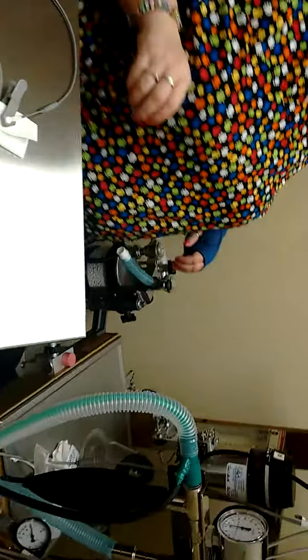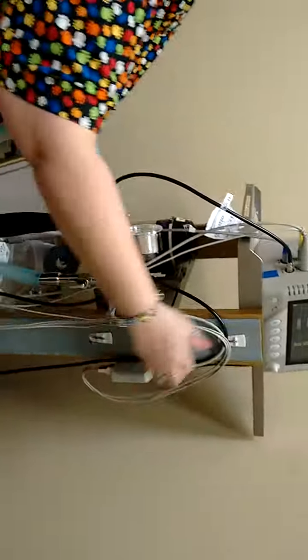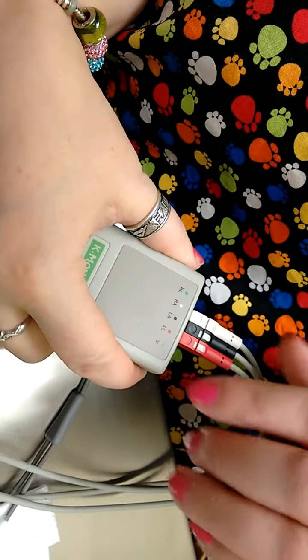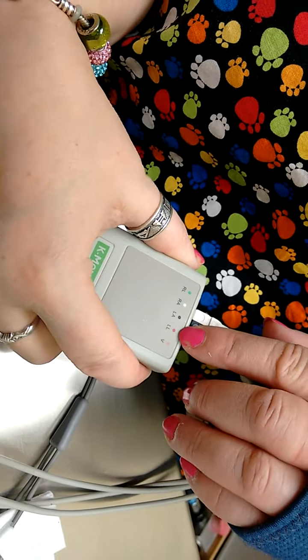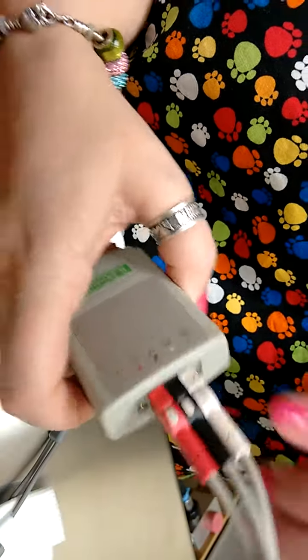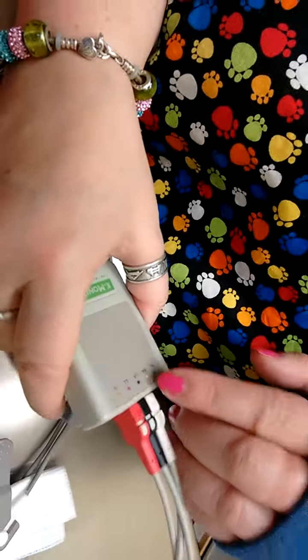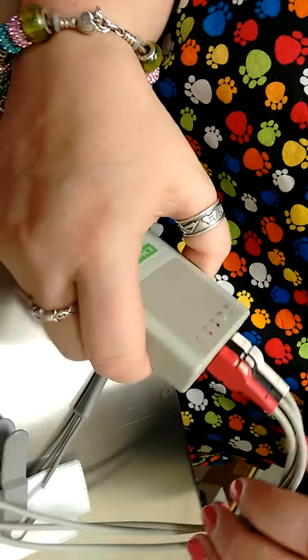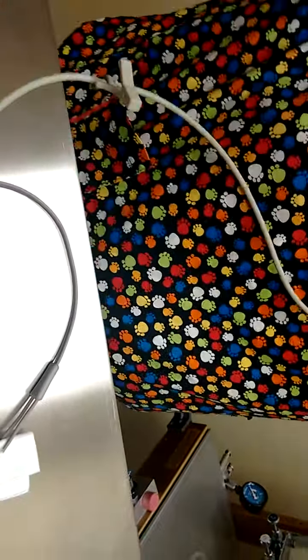What about the ECG? The ECG is labeled. It will say right arm, right leg, left arm, left leg. You could essentially have more. We only have right and left front and left hind, and it's enough. Some machines will have more.